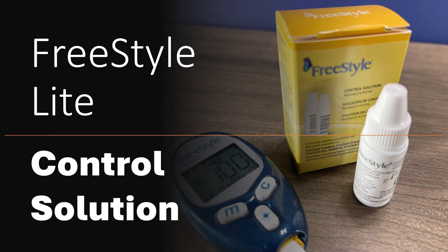Hi, this is Josh, pharmacist with Learn Blood Sugar Testing. Here we're going to talk about the FreeStyle Lite Control Solution, talk a little bit about when you use it and what it's for, and then I'll demonstrate how to use it.